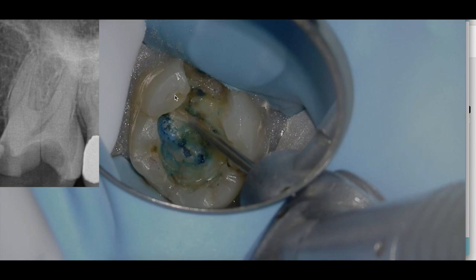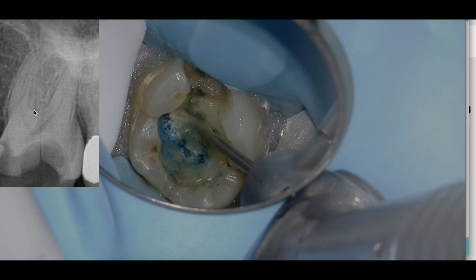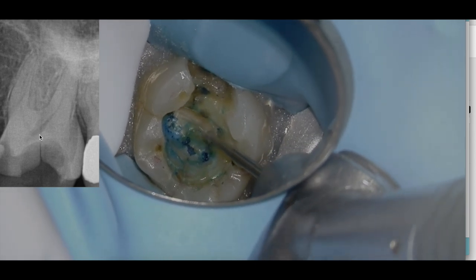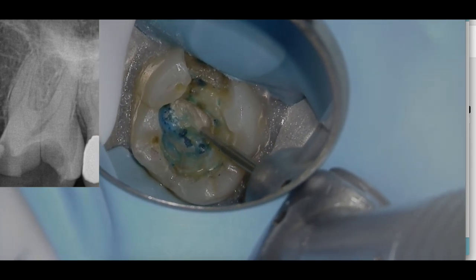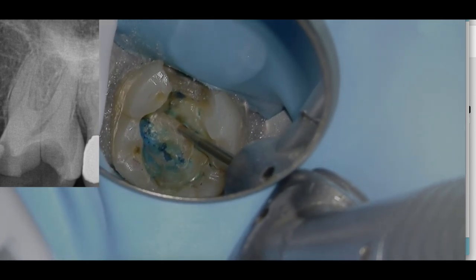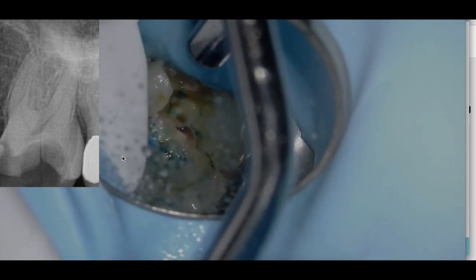I'm picking a spot between the mesial buccal cusp and the palatal cusp right here, and we're going to make a line back and forth. You can see that the tooth is actually not that calcified, so it's going to be pretty simple to get into it. My dental assistant is blowing air over this, which gets the dentin debris out of the way so you can keep a nice clean field. And you're going to see me pop into the pulp chamber right there. What that tells us is our diagnosis was correct - it's still vital. She did respond to cold, so that's to be expected.